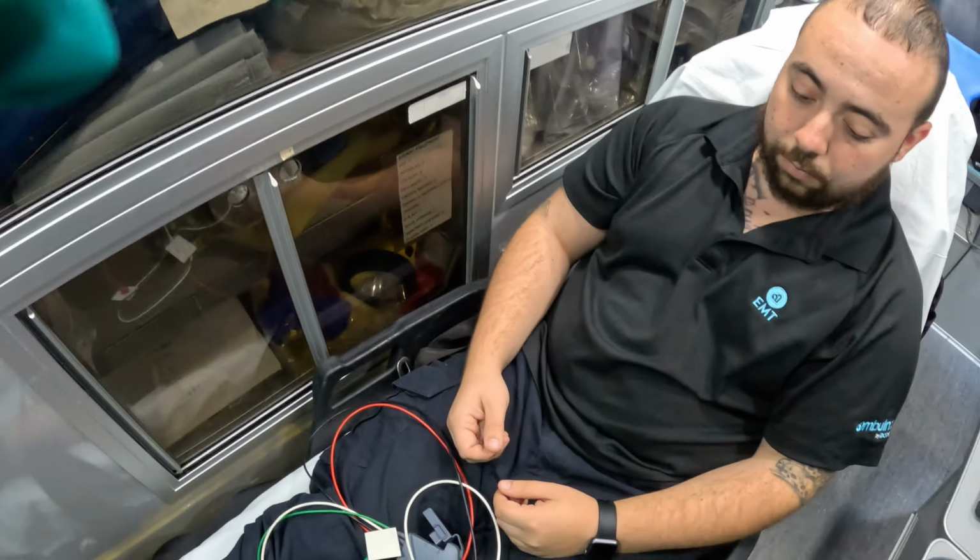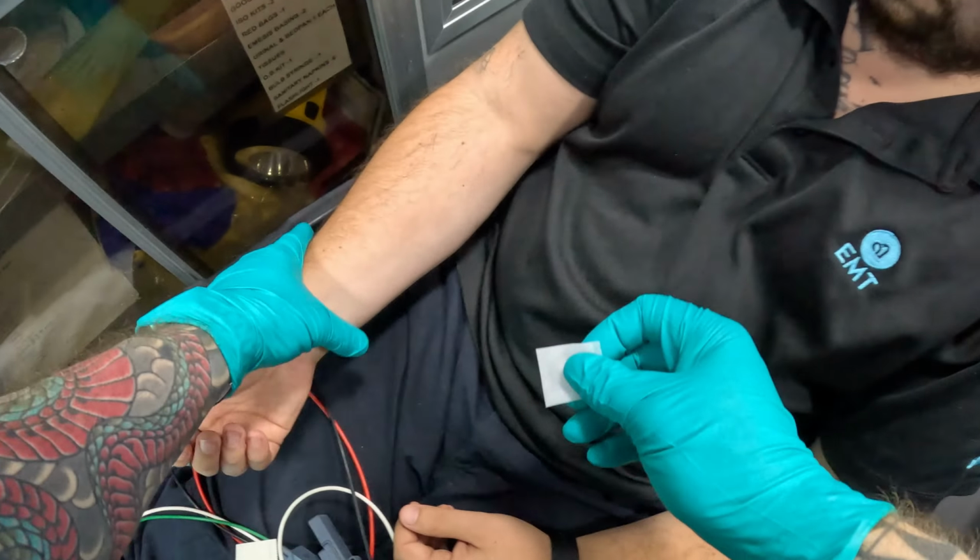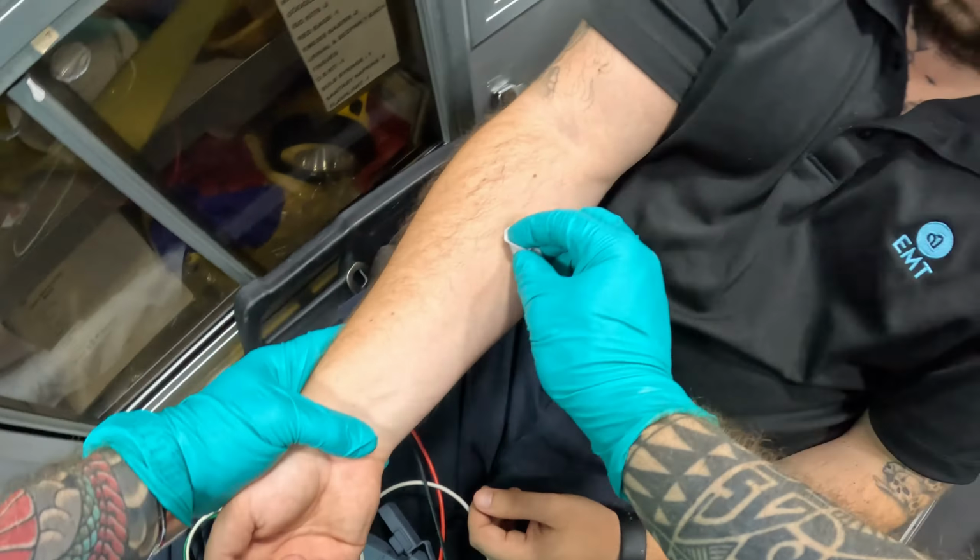So we got consent, so I'm going to just say, give me your arm. I usually like to cleanse the skin, and this is where I'm placing leads. I want to put it not in the hairy areas and where there are no bony prominences. So I clean here, I clean here. Usually I'm going to put it on the calves, right? So I would clean this side here. And what I'm doing is basically I'm just abrading the skin, right?